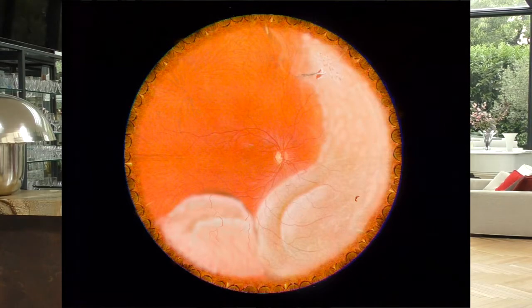It has a very tight vitreous traction which will have to be released. The second at 4:30 occurred secondarily, and the very relaxed aspect of the traction shows that it may not be mandatory to relax it, especially since there is no circumferential fold and the posterior hyaloid seems to be detached all around.